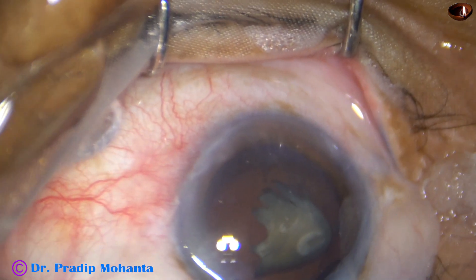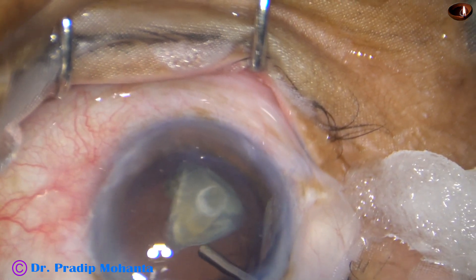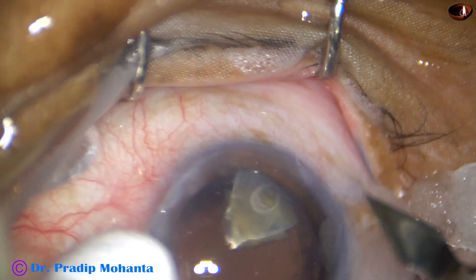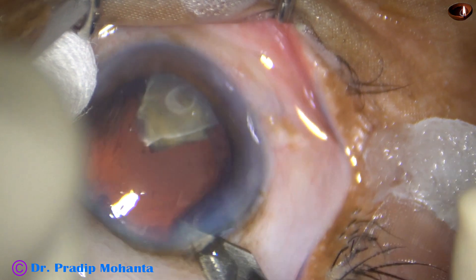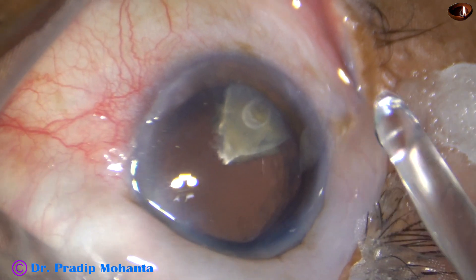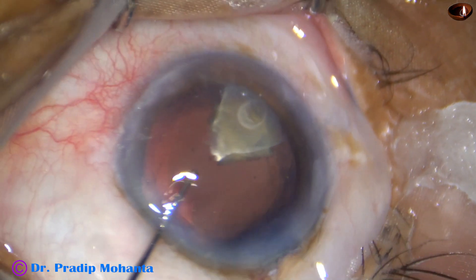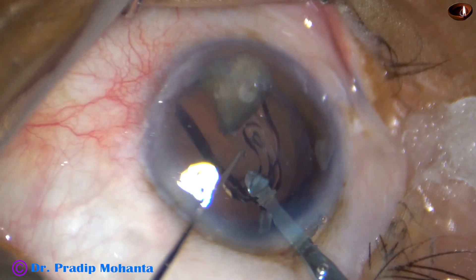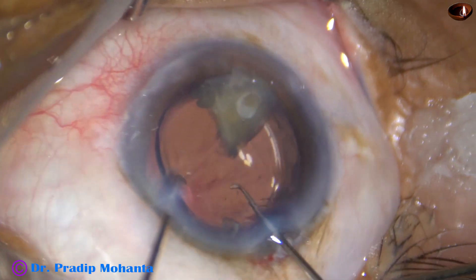Now I inject 2% hydroxypropylmethyl cellulose, fill up the capsular bag and the anterior chamber. In this case I enlarge the main incision a little bit, just by 0.2 mm, because I was using a B cartridge. Now I implant the lens.